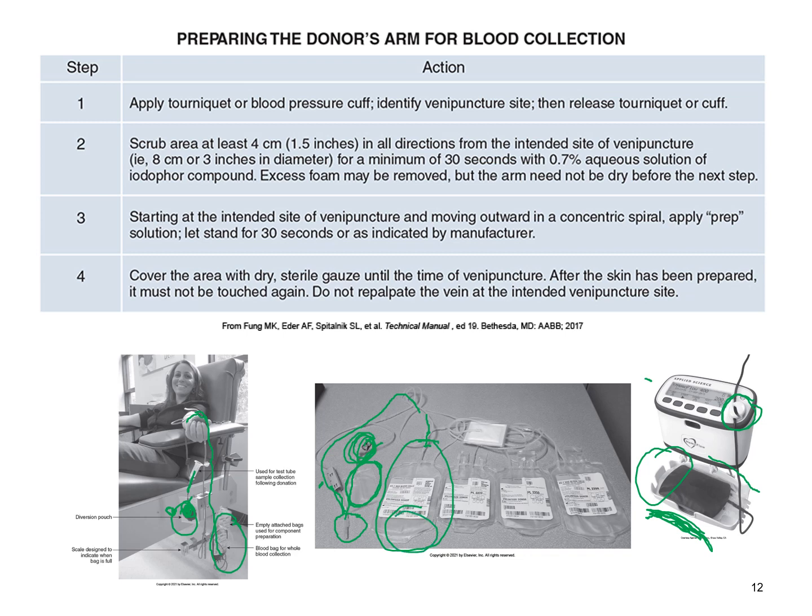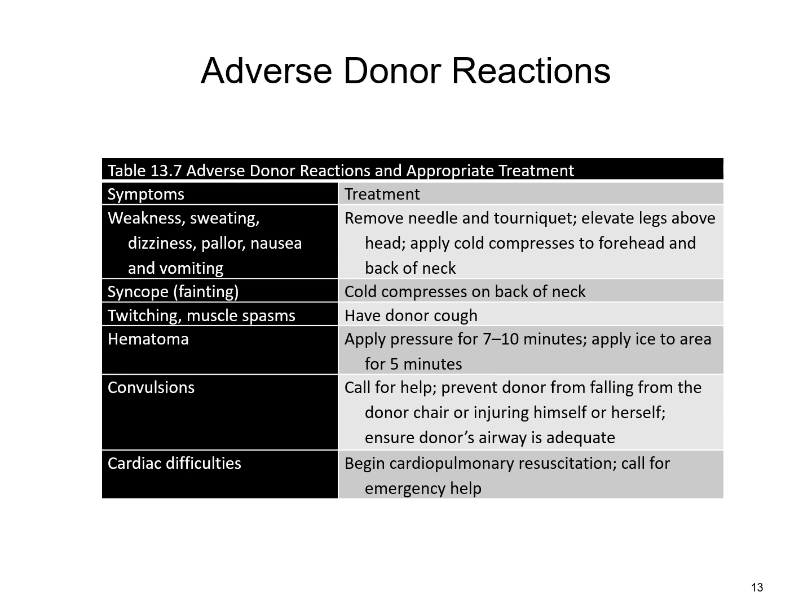It's hard to see here, but there's usually something in there, a preservative, anticoagulant, that will help those units to survive while they're in storage and prevent them from clotting up and things like that. Now keep in mind that anytime you have a donor go through this process, it can be a little traumatic to the system, losing that blood volume pretty rapidly.